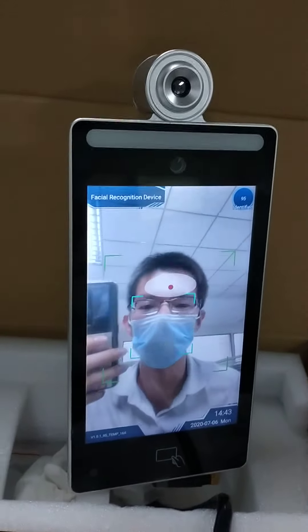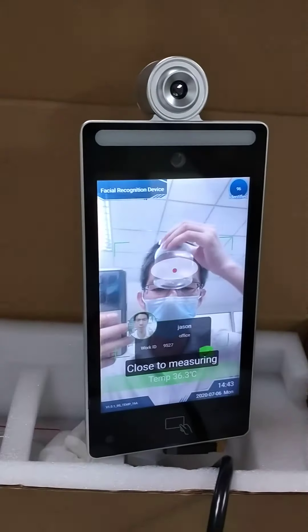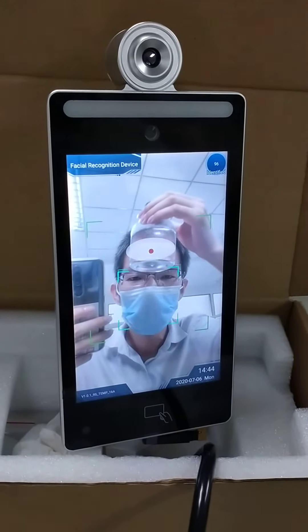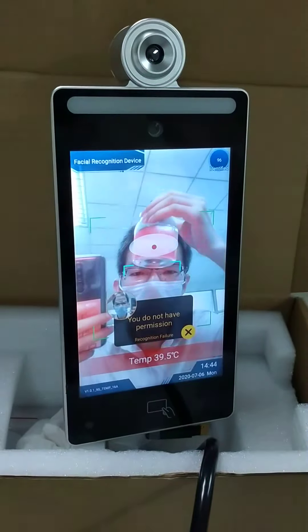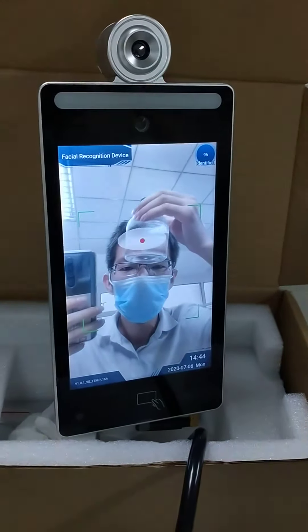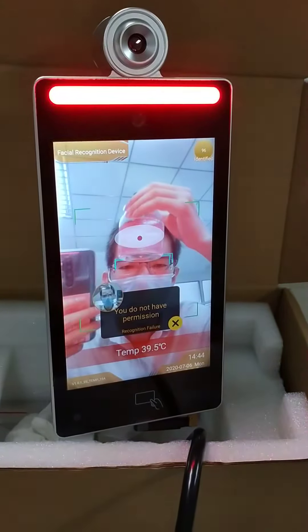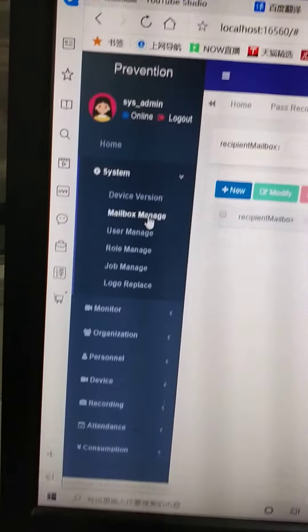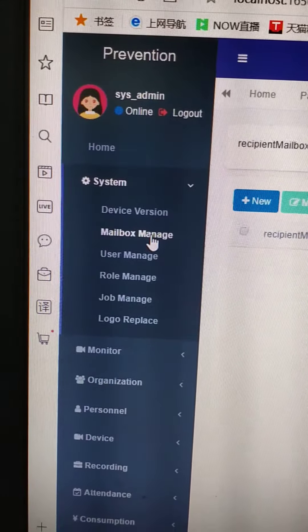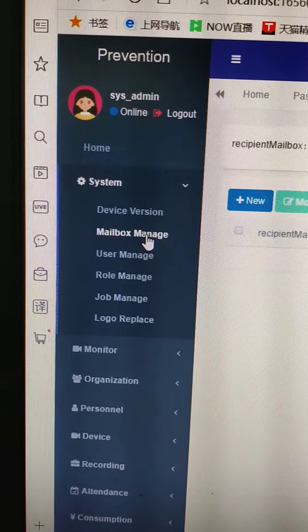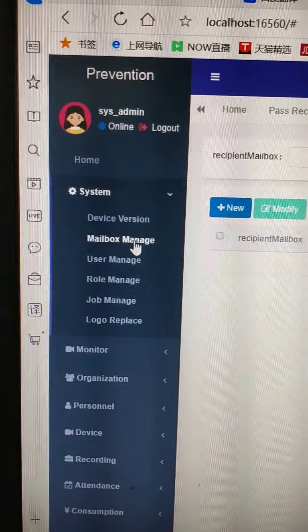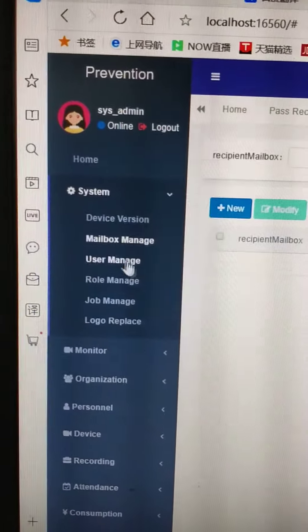For example, now here's the fever. CarSafe developed a software that has the function of sending a fever alarm email to the administrator. Let's see it.